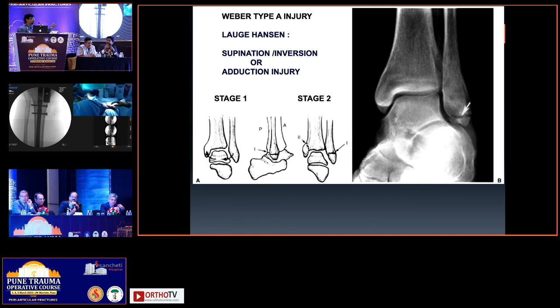I opened up the distal fragment completely. I put a small spike under it and got a space. I know to use a good cortical; I did not enter too much inside, otherwise it will go into the medullary canal and become loose. So I just kept it near the fracture site, and then I sutured it.